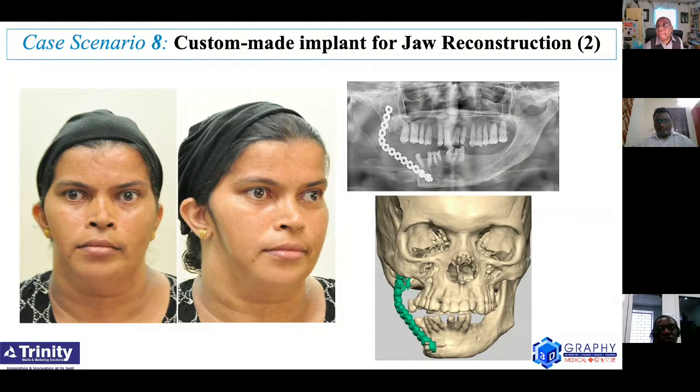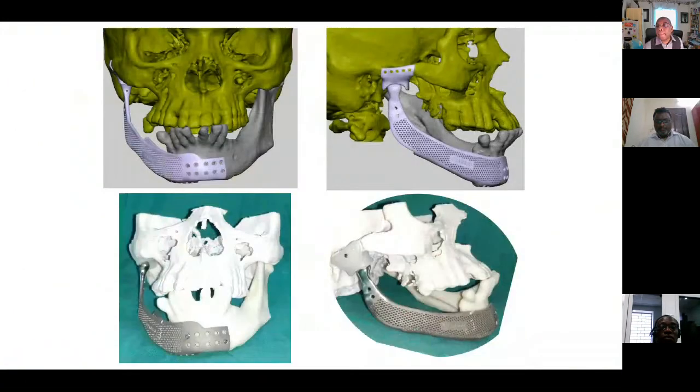This is another patient operated elsewhere, came back with the hanging plate there, requested for me to do possible prosthesis. John was my messiah. We sent him the CT scans. He fabricated this particular STL model. And then on the STL model, we sat down and possibly thought of a design. Today, if I have to look back into these cases, which are 2 to 3 years old, we have reformed a lot based on the STL model findings and, of course, findings from the patients themselves.